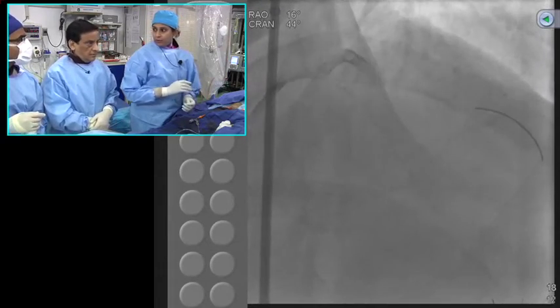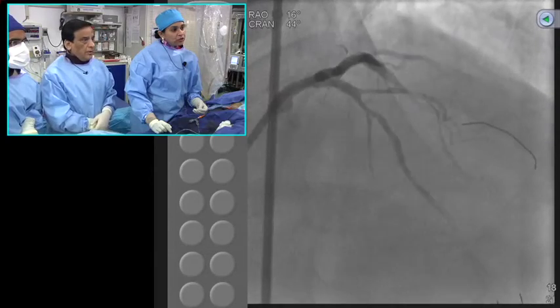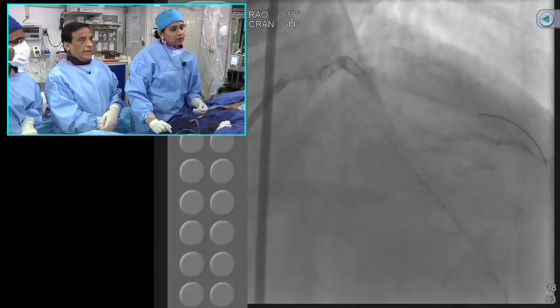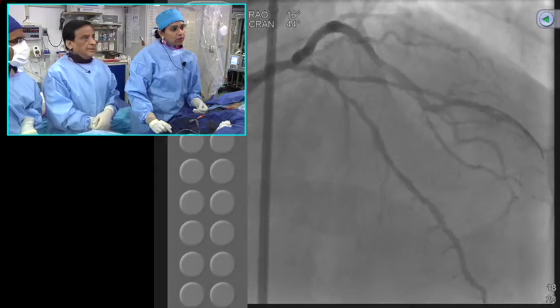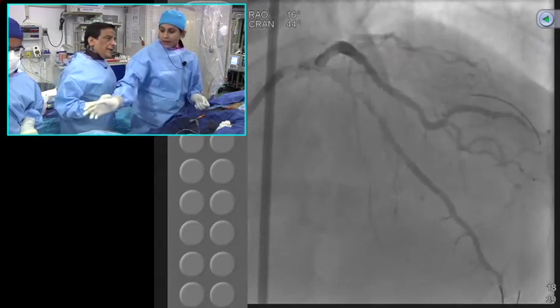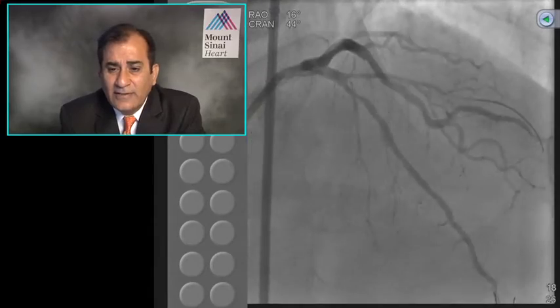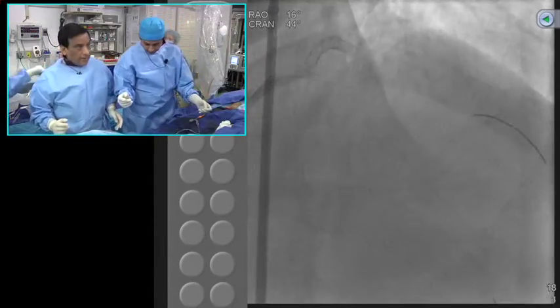For the diagonal, you want to stent across the lower branch? Is that what? No, upper branch. The wire is in the lower branch now. Right. Yeah. So we'll stent into the lower branch, and the upper branch will be okay. Now, the question is actually an important point for the predilate. The view which we are seeing is showing it in the upper branch. That's why. No, sorry. We just wanted to show. You want to take a picture? Yeah.